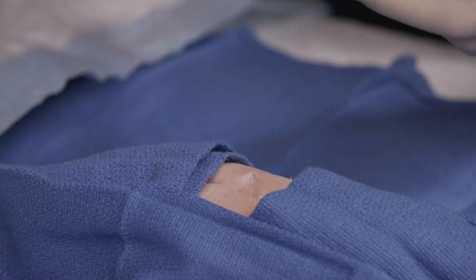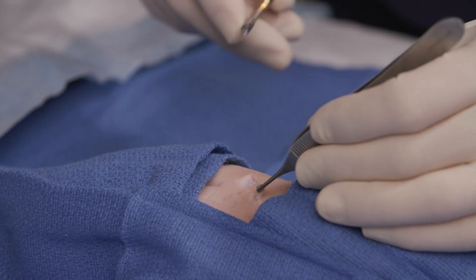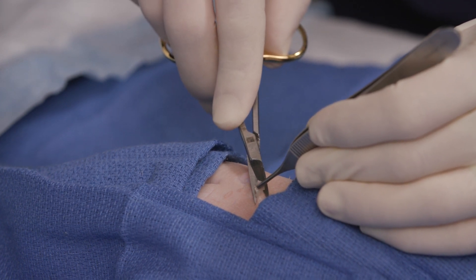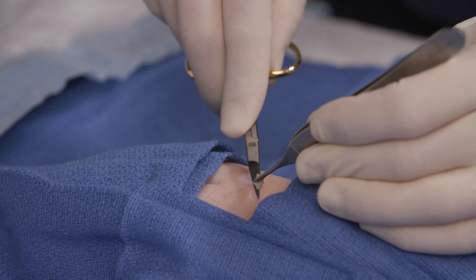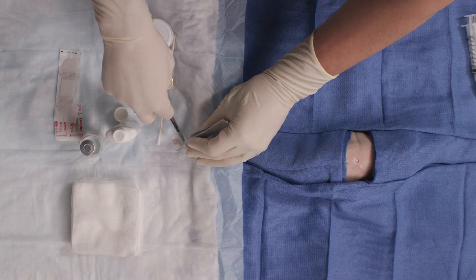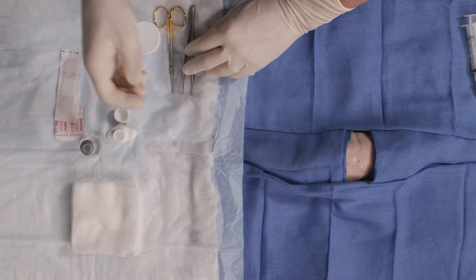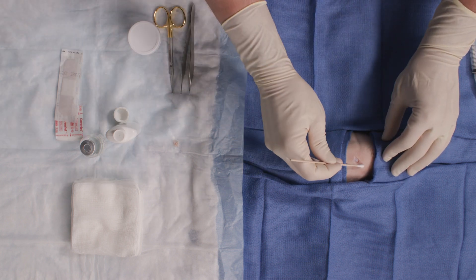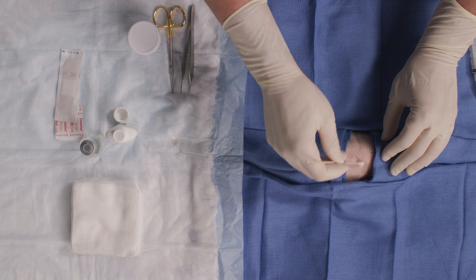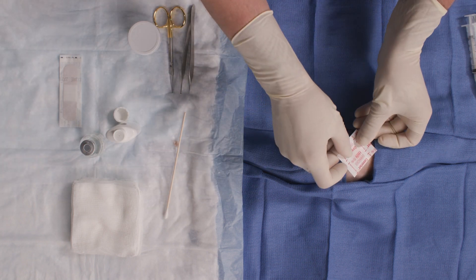Then I can move on to the second lesion. Again, grasping the skin tag with the pickups or the forceps, raising it up so I can clearly see the stalk. Then I want to confidently cut, making my snip excision with the iris scissors. I'll set that aside, then grab a little more Drysol and apply it directly to the snip site. Make sure it's hemostatic.